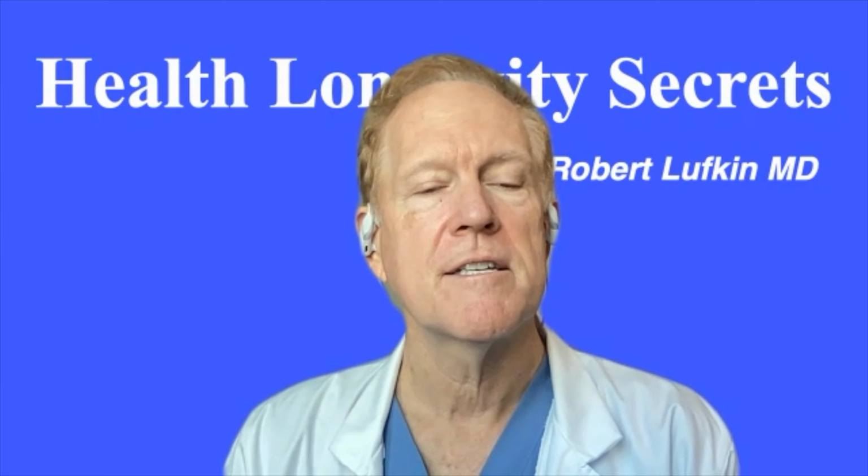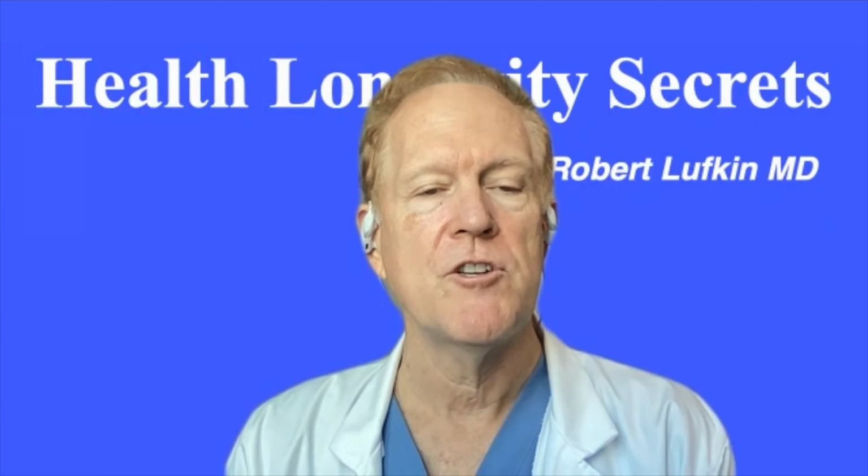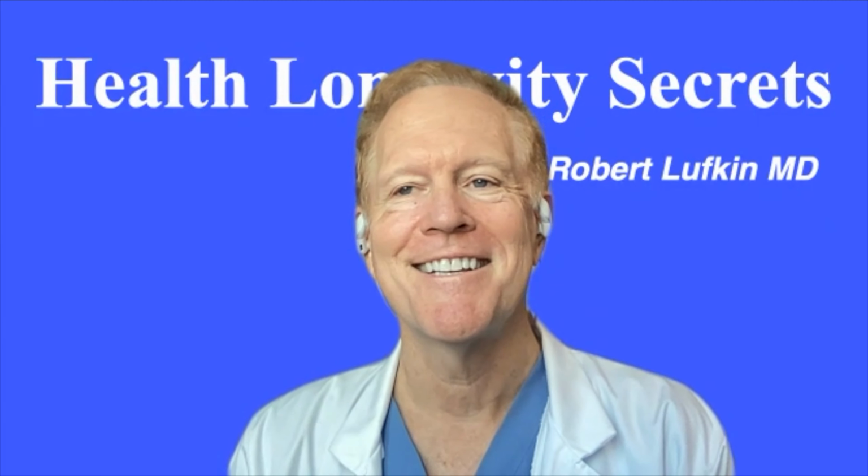How long does the scan take? What is the experience for a patient when they come in for one of these studies? So it depends if you're appending this to an already prescribed MRI scan for other reasons, then it only adds about 6 to 8 minutes roughly. But if you're doing the scan only for this analysis, then you also have to add the time of getting into the scanner and out.